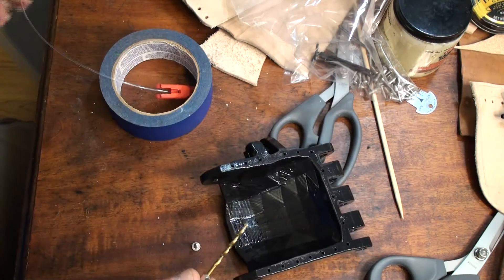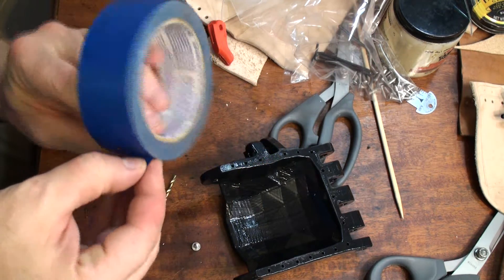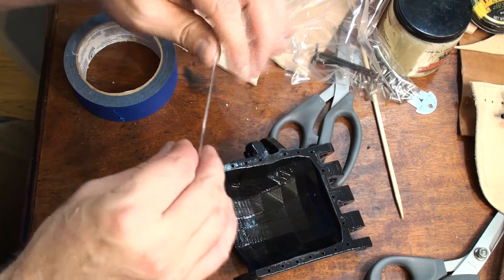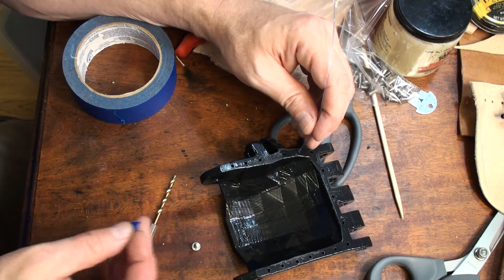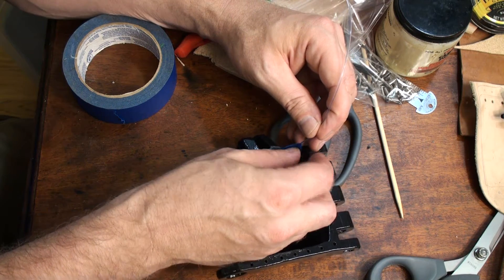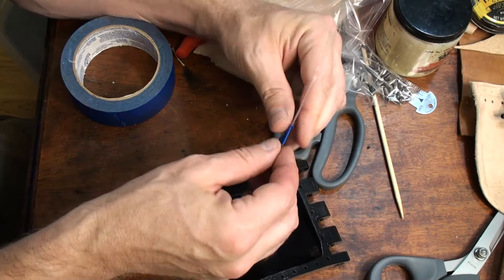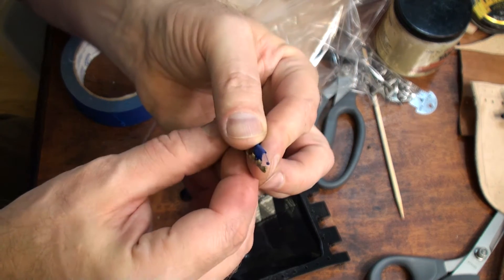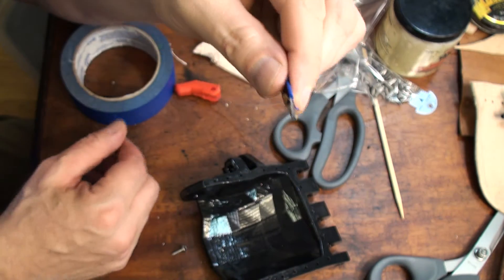We're going to measure the depth of the holes first. Grab a little piece of tape and something thin — I've got a little bit of nylon monofilament, but you could also unfold a paper clip. Find one of these holes, which are all about the same depth, and tape a little piece on top to mark how deep that hole is. Now you can see the depth of the hole — that's how far I want to drill in.